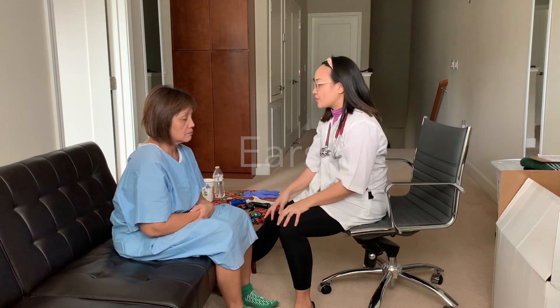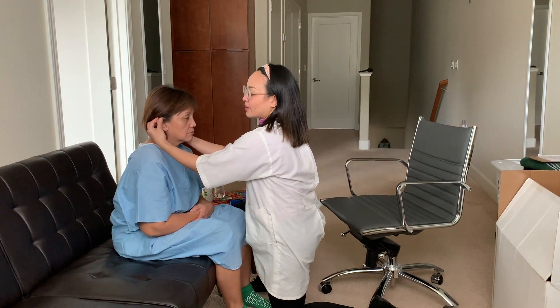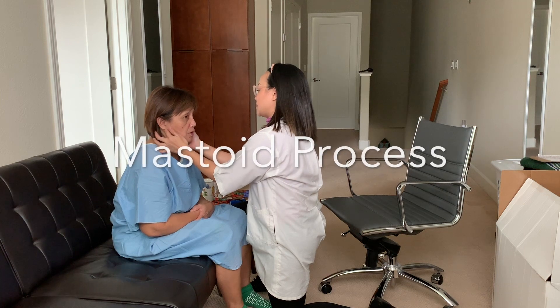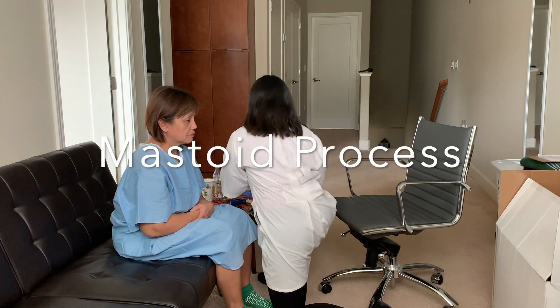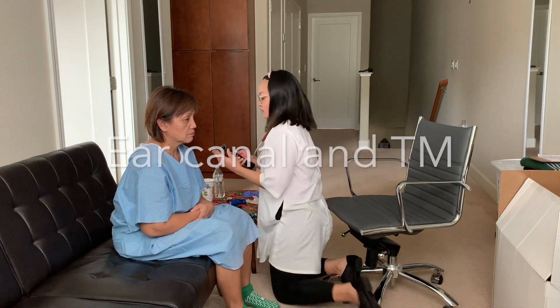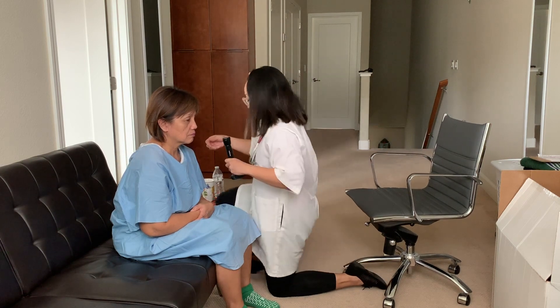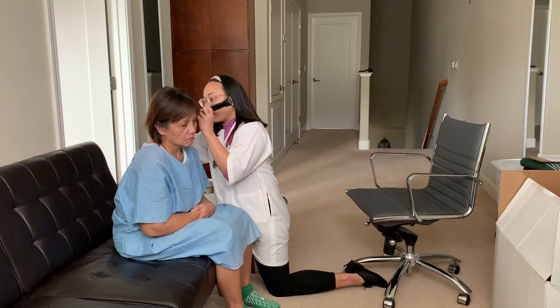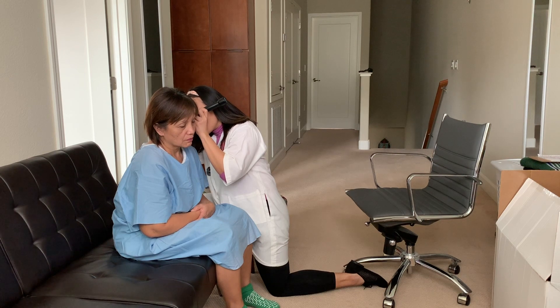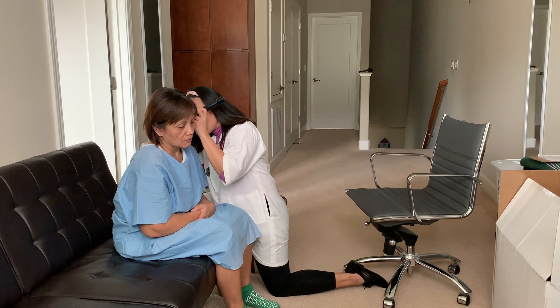Now let's go to the ears. I'm going to inspect and palpate the ears. Palpating the auricle — any pain here? No. Any pain in the mastoid process? No. Now we're going to look at the ear canal and the eardrum. Pulling up and out. Looking at the tympanic membrane, looking for the cone of light, the malleus, the umbo, the pars flaccida, and pars tensa.